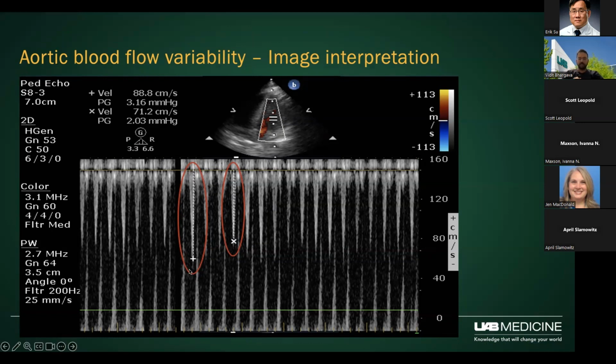Alternatively, if we're using just the maximum velocity, then you pick the largest and the smallest peaks and measure only that maximum point. This is sometimes helpful when anybody is starting with this, because sometimes doing a trace can be a little bit more technically challenging and can introduce error because of that. And just measuring the peak velocity can be a little bit easier to do.